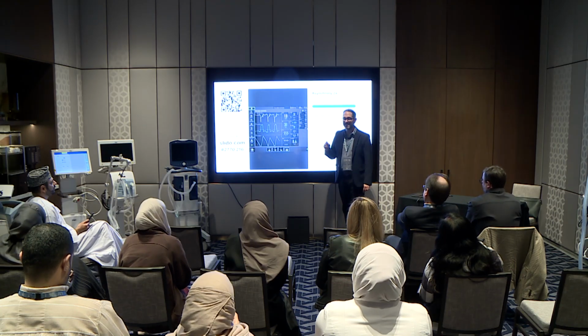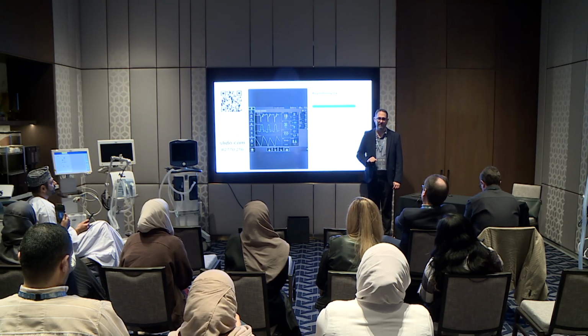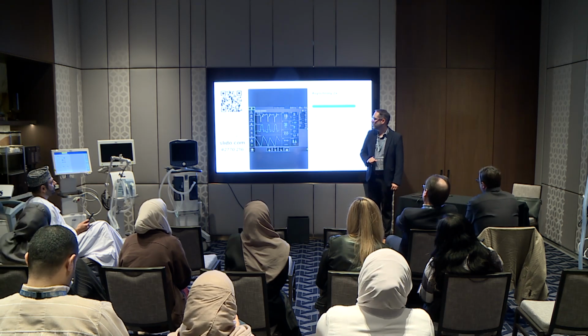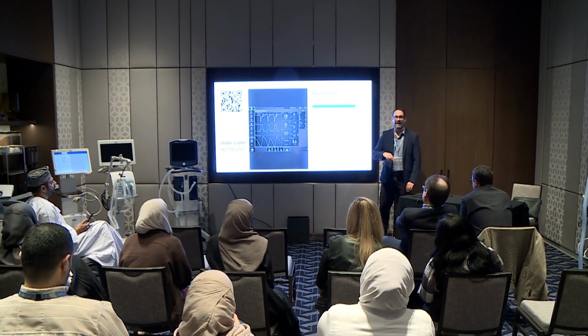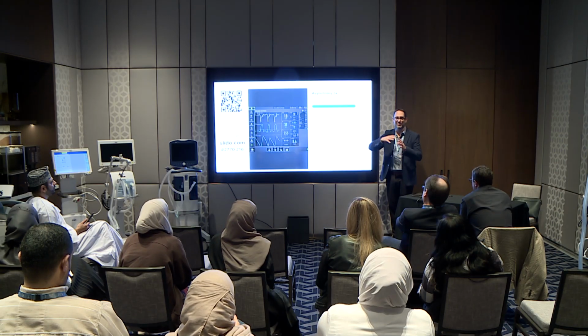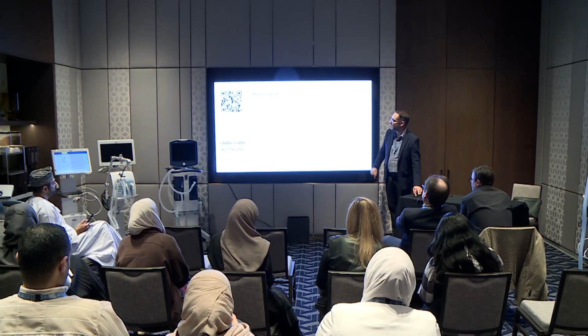My P0.1 is 9.6, which indicates a very high drive. Normal is 1.5 to 3.5, as was pointed out already. So this patient's clearly under assisted. Having said that, I pointed out that even trying to switch the mode and everything didn't work, but let's see, what's the problem here?